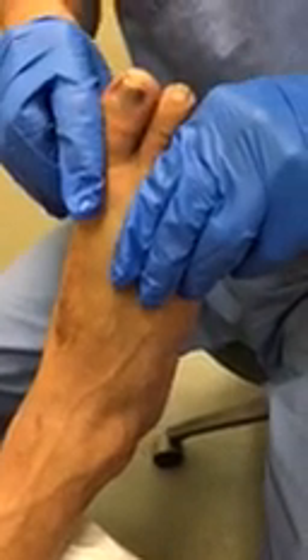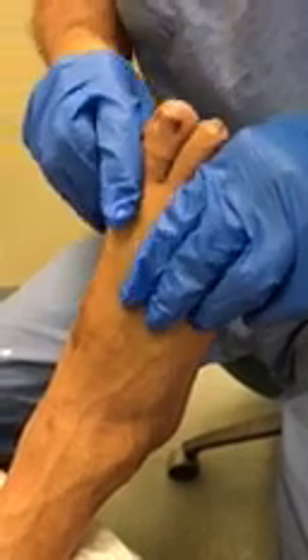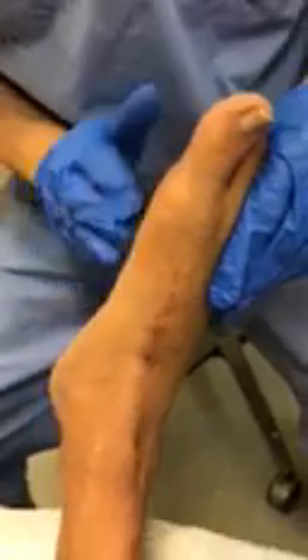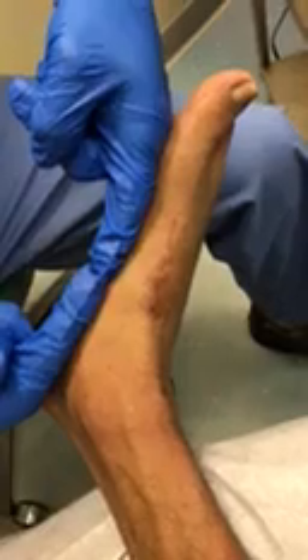As we move the big toe, the whole column doesn't move because the entire column has been fused. As I'm trying to move it, there's nothing. The alignment and the arch elevation has been achieved as well in comparison. If we shoot this side, we can see more of this in comparison to before.